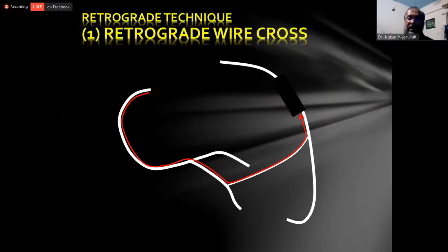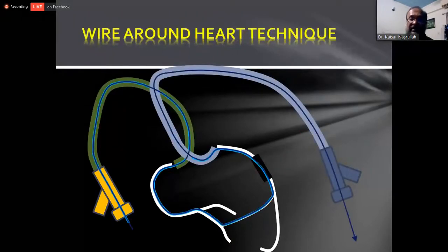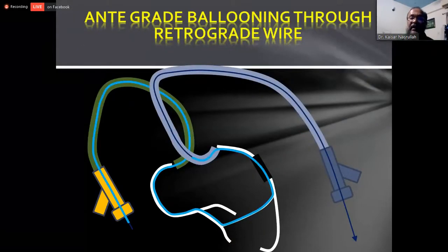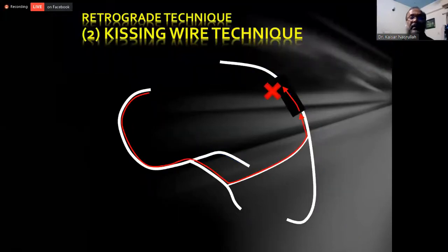Take the retrograde wire, hit the CTO from the back, cross it, reach the proximal lumen, then go to the antegrade guide catheter, and then take the antegrade balloon over the retrograde wire and dilate the lesion and stent. Finish. Next is the kissing wire technique.